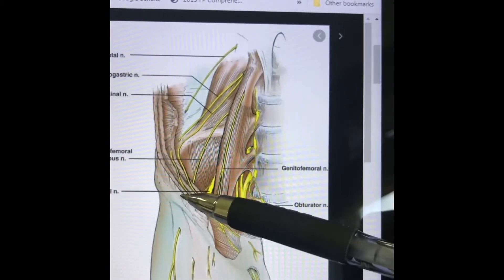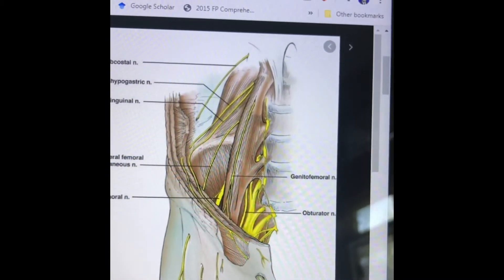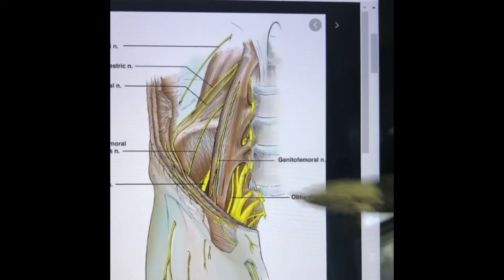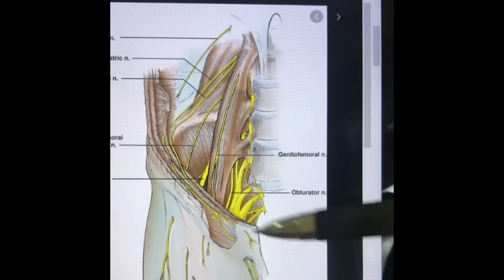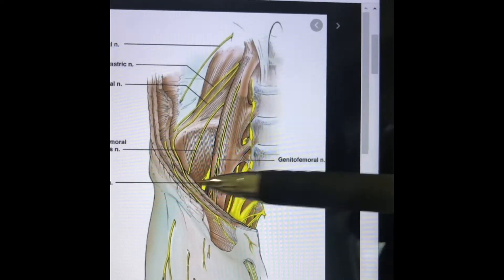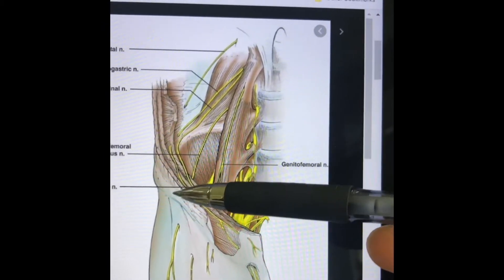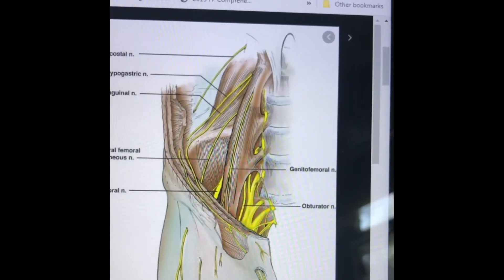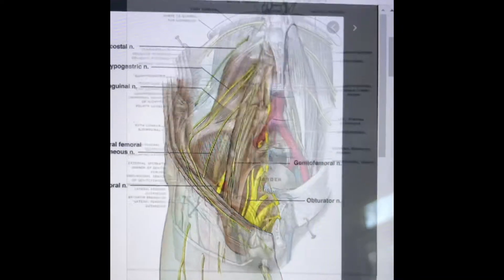Once it gets down to the ASIS, it can then travel deep to or through the inguinal ligament as it moves out of the pelvis and into the thigh.